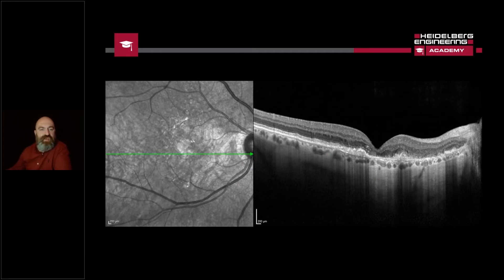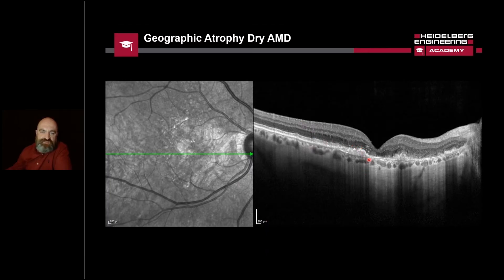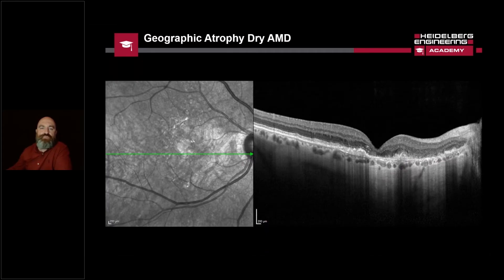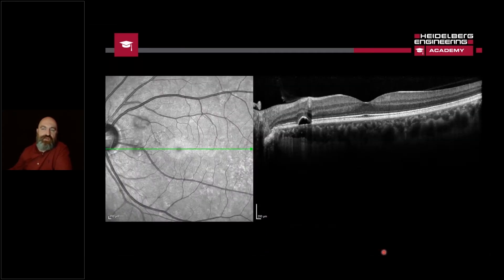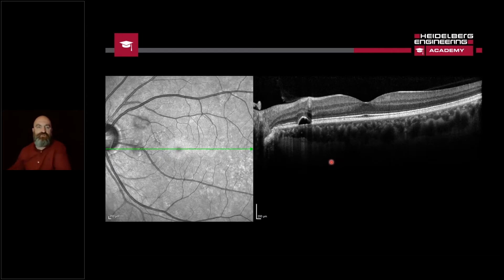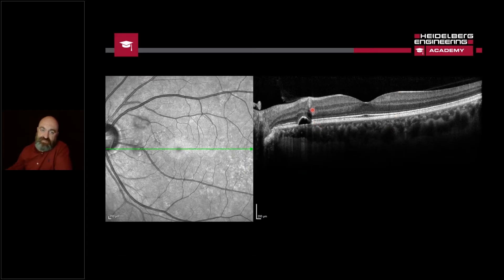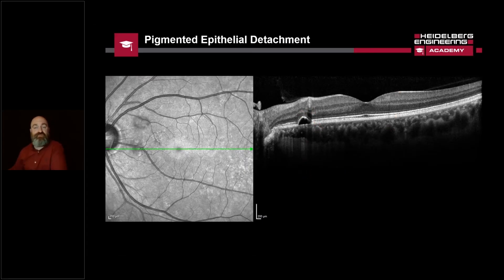What you can see on screen here is a more flat, quiet retina, but there are some significant changes that make it different from a normal retina. Here we can see geographic atrophy — the waterfall or barcoding effect is very common when you have atrophy of the retinal pigment epithelium, like we see in dry AMD. Cases like this are very common now in primary care, because so many asymptomatic people are having OCTs. Lots of optometrists find that patients have little pigmented epithelial detachments and had no idea until they had an OCT.